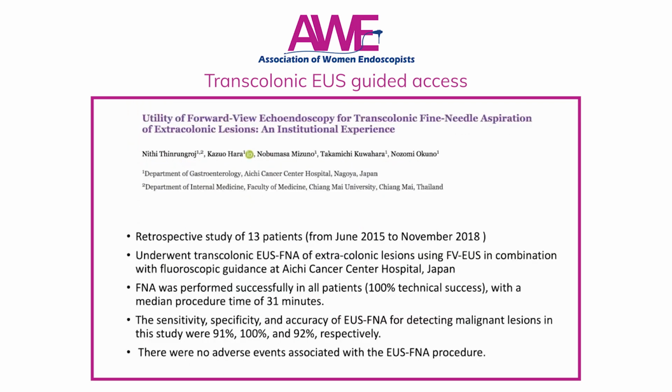So in this publication, it was a retrospective study of 13 patients over a 3.5-year period. All these 13 patients underwent transcolonic EUS-FNA of extracolonic lesions using the forward viewing Olympus scope together with fluoroscopic guidance. FNA was performed successfully in all patients with 100% technical success, with a median time of just 31 minutes.